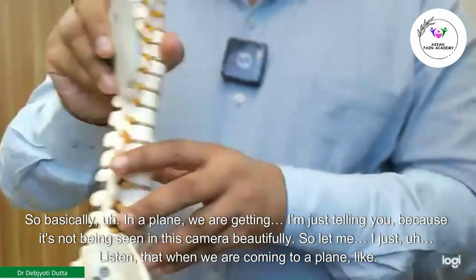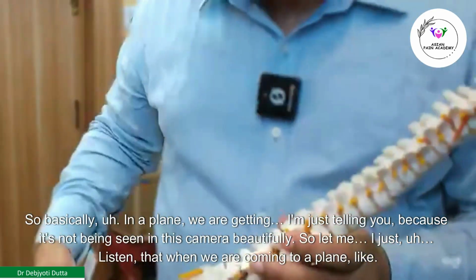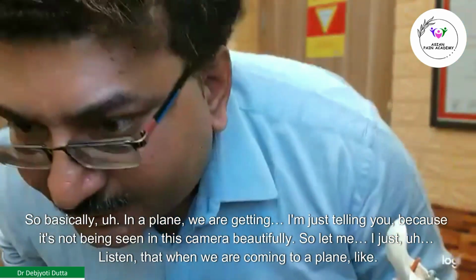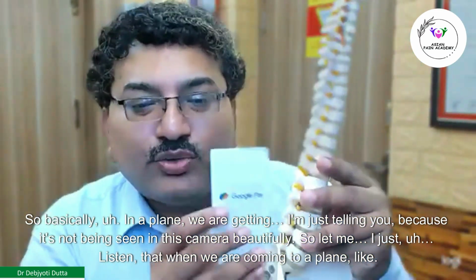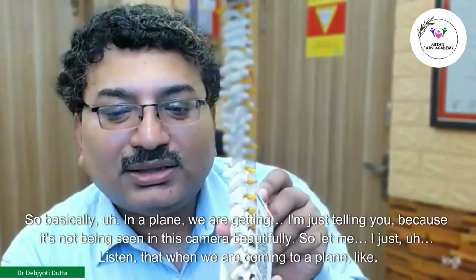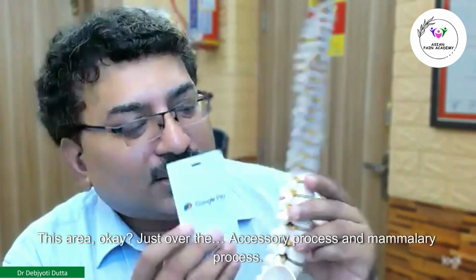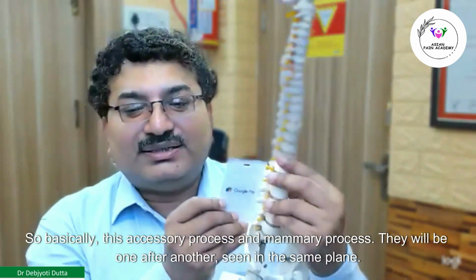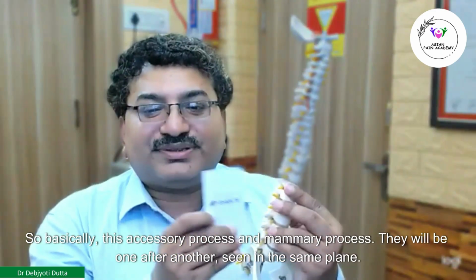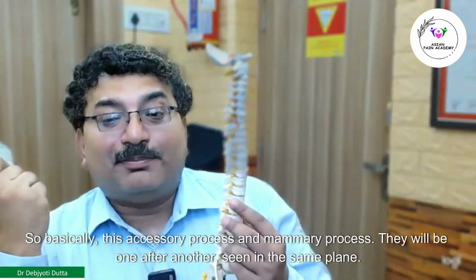So basically, in a plane, I'm just telling you because it's not being seen beautifully in this camera. When we are coming to a plane like this area, just over the accessory process and mammillary process, these two processes will be seen one after another in the same plane.